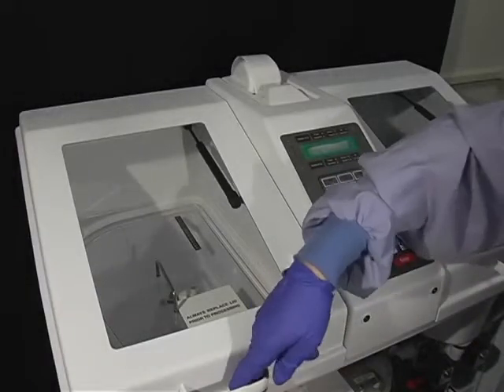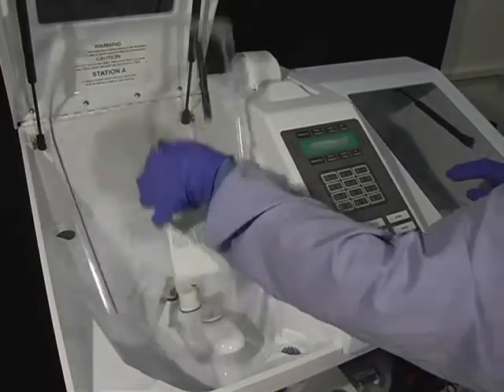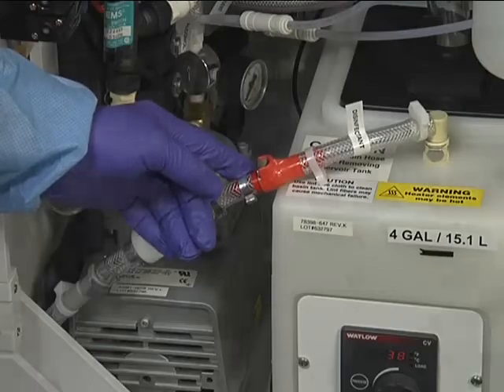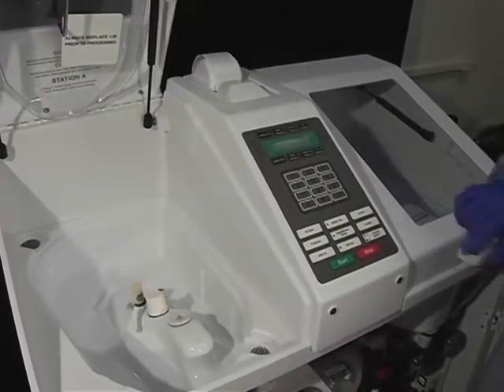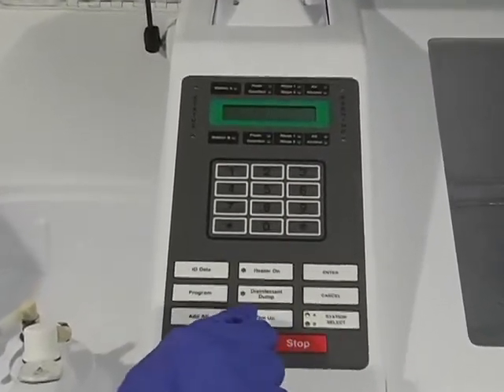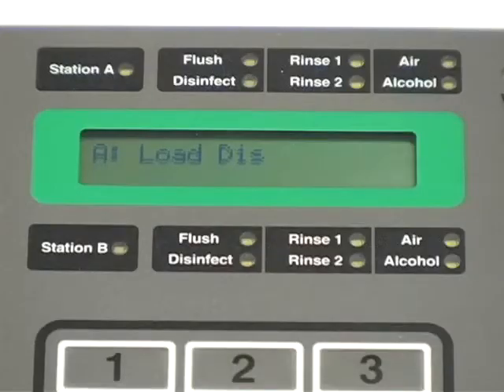Now let's demonstrate the other method for loading disinfectant through the basin. First, change the disinfectant filter. Choose the appropriate station on the control panel. Press Setup, then press 1 on the numeric keypad, and then press Enter. On the LCD screen, the letter of the station you are loading will show, followed by 'Load Dis.' Press the Start key. The DSD-201 will prompt the user to 'Attach Restrictor' — ensure that the basin restrictor is snapped into the basin connector port before pressing Start again. For DSDs with the leak test option, there will be a 40-second delay.